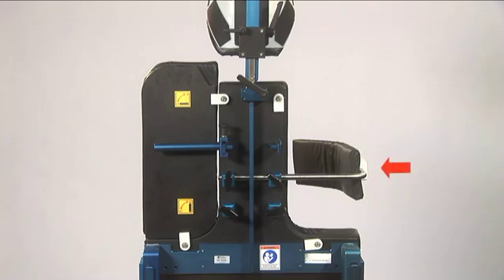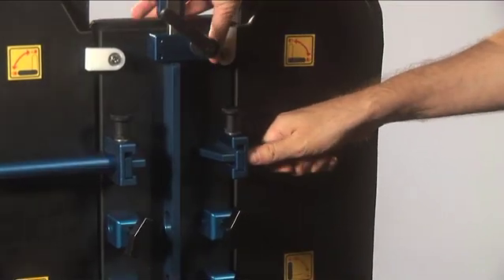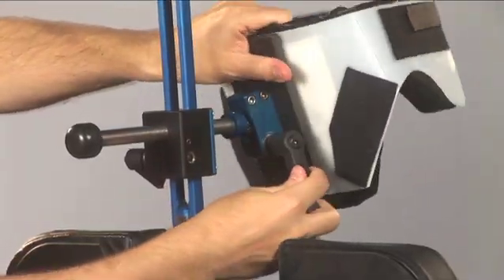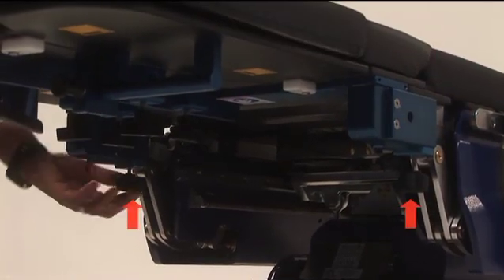Once the procedure is complete, remove the lateral brace and insert the shoulder panel once again. Straighten the patient's head and loosen the slide locking knob and top ball joint to allow the head to move as you return the table to the level position. Once the patient has been transferred from the table, loosen the locking knobs on each side of the shoulder chair.